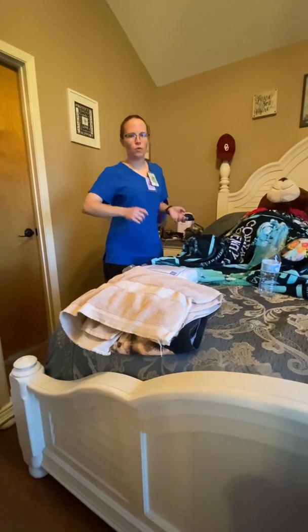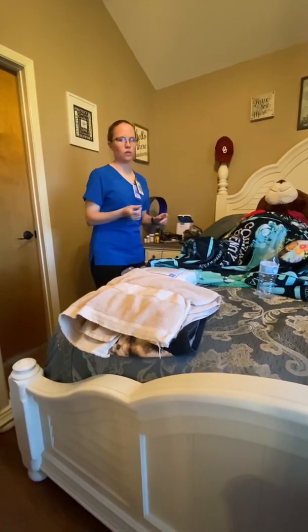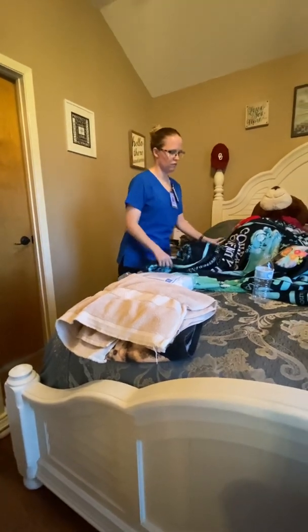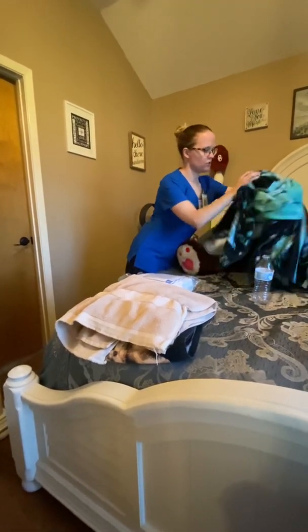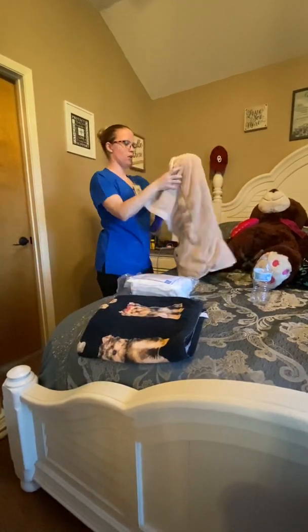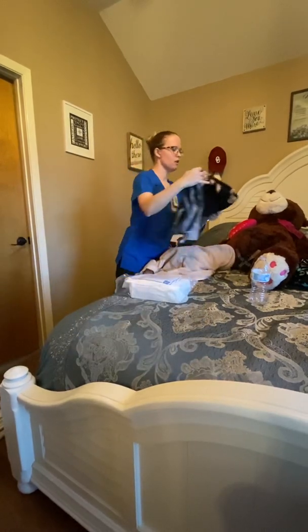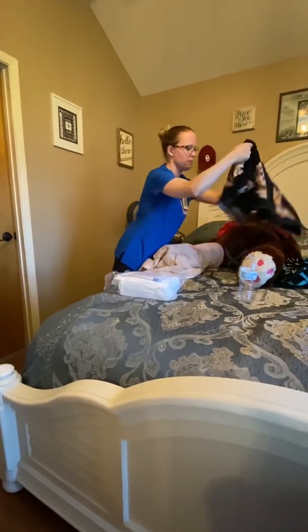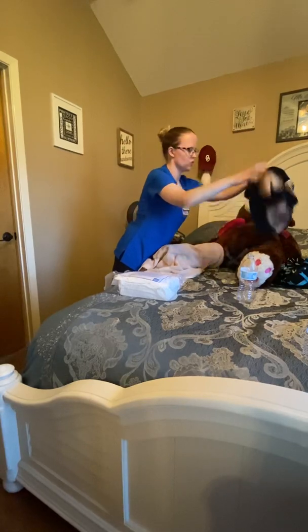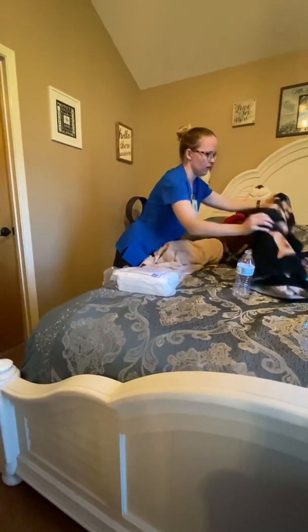Next, we're going to apply our gloves, and then we're going to cover the patient up with bath blankets. For a female patient, we'll have two bath blankets, one for each leg. And for males, we just have one bath blanket that's just covering their legs from about the thigh down, and then have one above their abdomen.